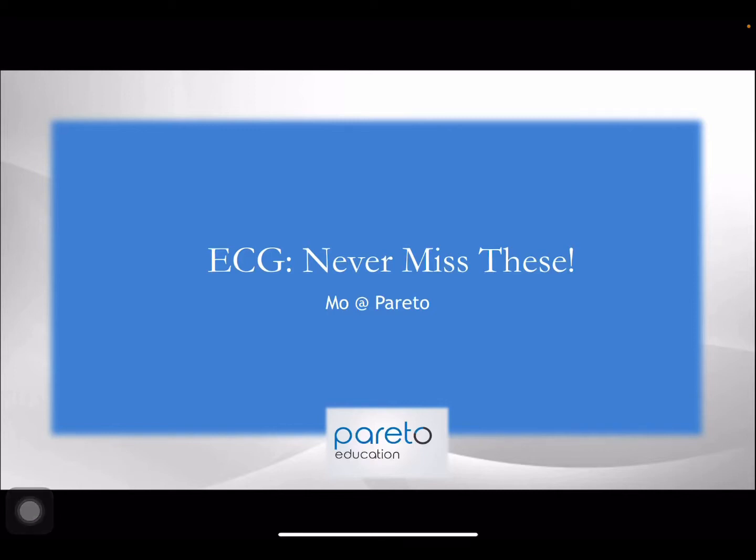Hello everyone, it's Mo here from Pareto and I'm here with another Pixel, and today we're going to be going through some ECGs which you must never ever miss, not only for your OSCEs but also for your writtens.